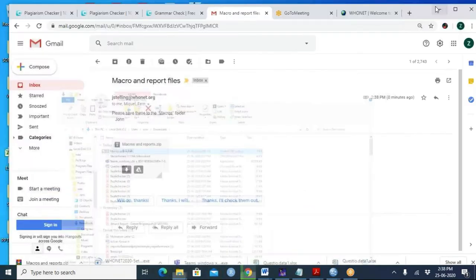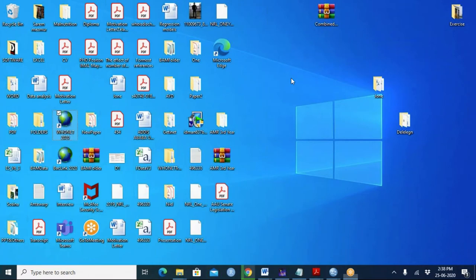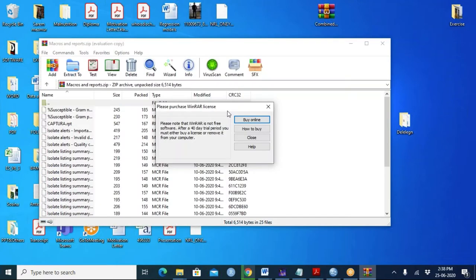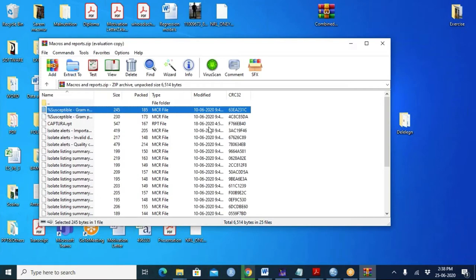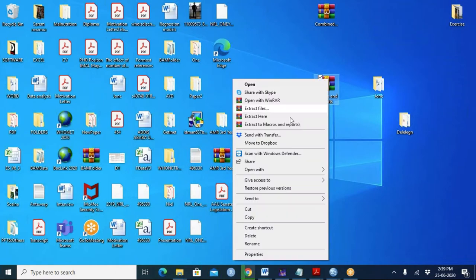Yes, copy and paste that into your macros folder. I'm going to copy all the items within the folder. Okay, let's do it a different way. Close this right now. Go back to your downloads folder. Yeah, this one. This is a document. Good, perfect. Cut and paste that into your WHONET macros folder.